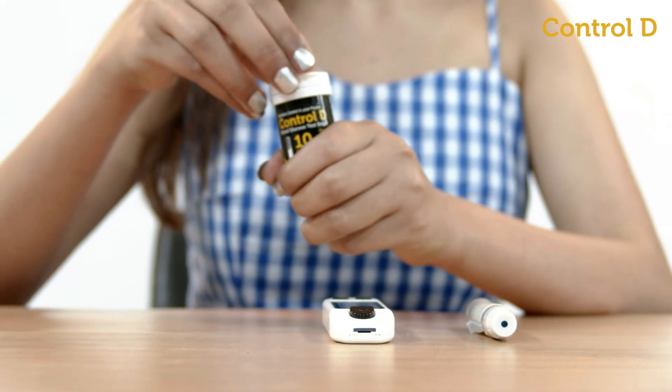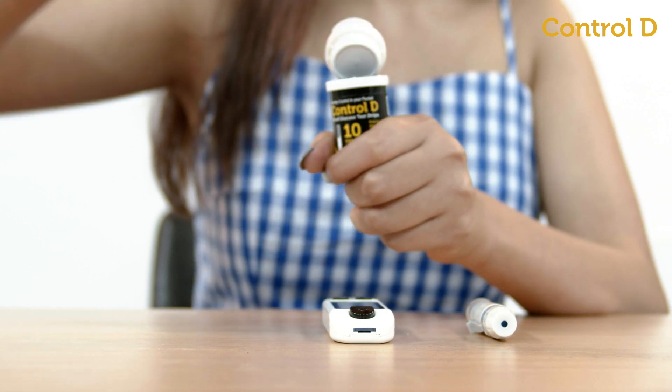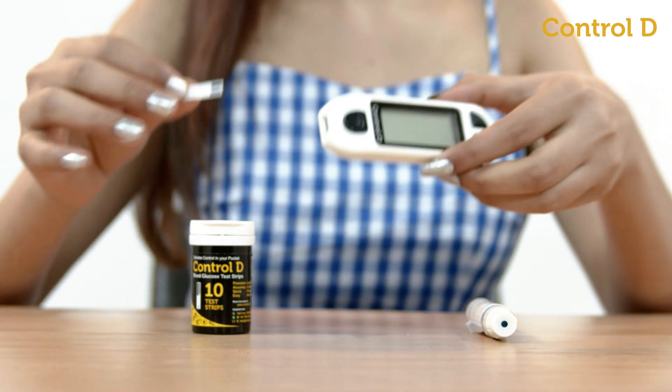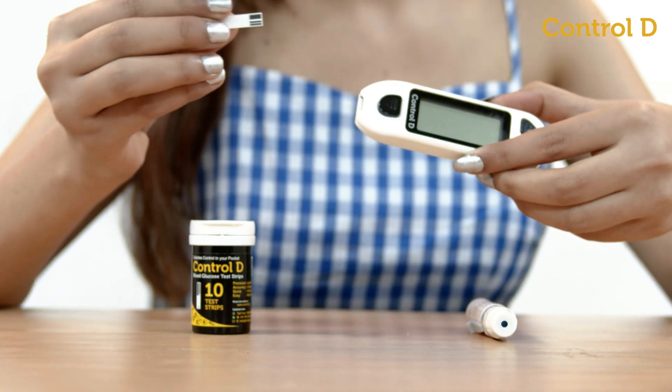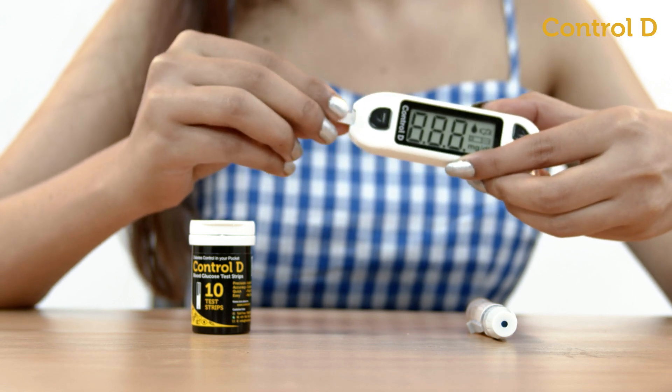Open the test strip box and take out a test strip. Ensure to close the strip box immediately. To test, start with the meter switched off and insert a test strip with the black part going into the meter.